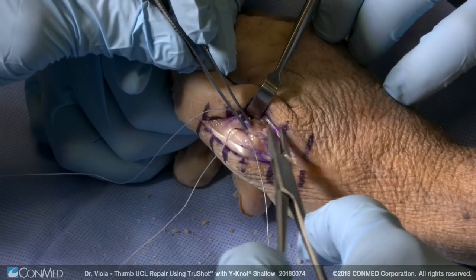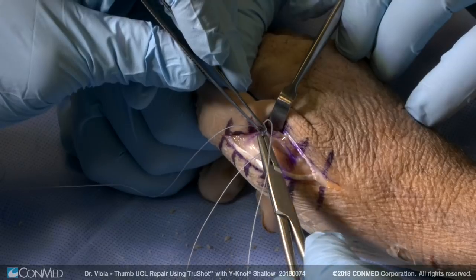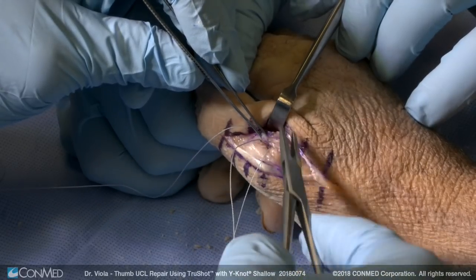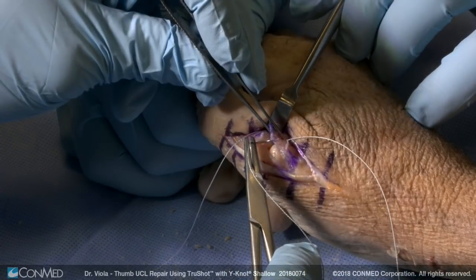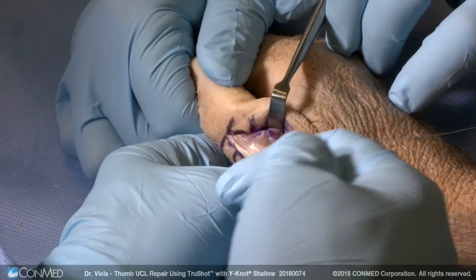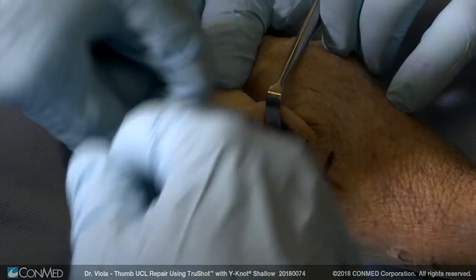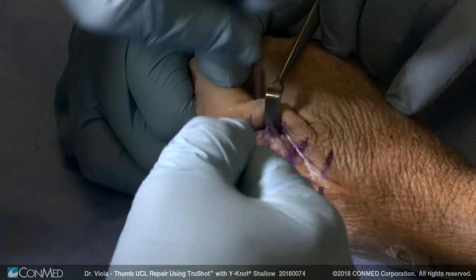We put one locking stitch through the ligament. I place the mattress suture through the volar aspect of the ligament, then bring the dorsal suture through the ligament in mattress fashion. Remove your needles and take the dorsal stitch, which is passed freely through the ligament, and use that to tie the ligament snugly to its insertion.